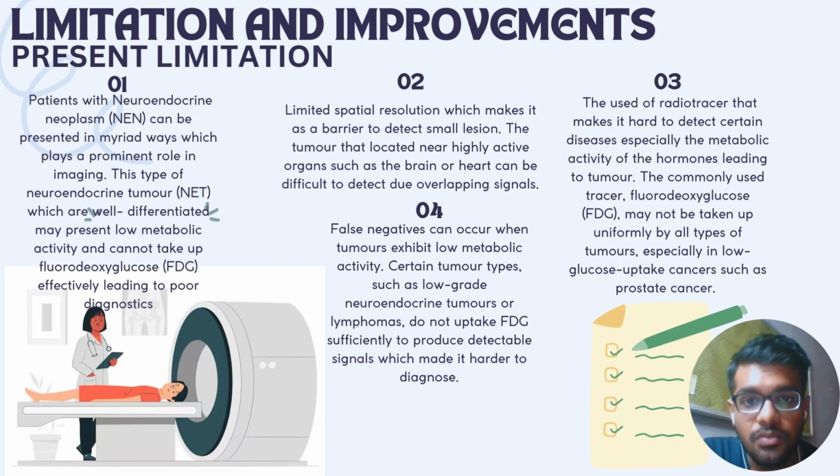Last but not least, false negatives can occur when tumors exhibit low metabolic activity. Certain tumor types such as low-grade neuroendocrine tumors or lymphomas do not take up FDG sufficiently, which produces undetectable signals, which makes it harder to diagnose.